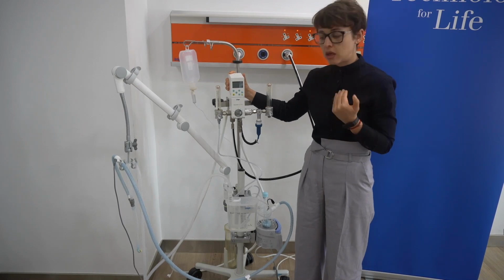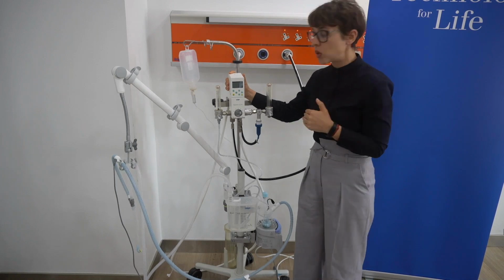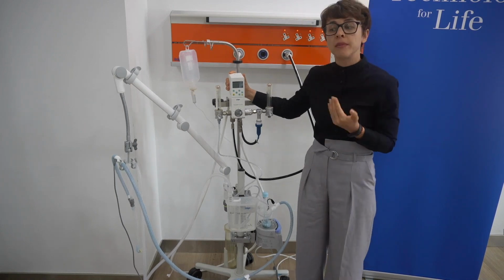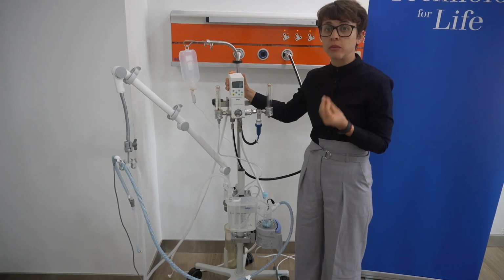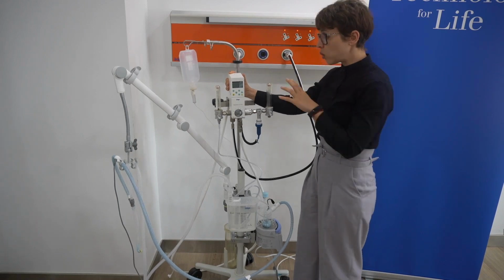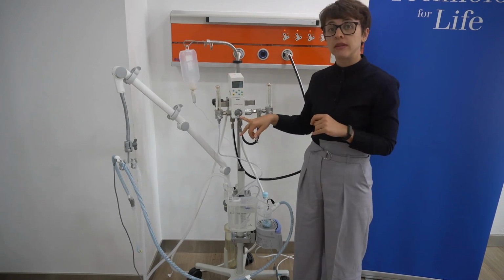Especially we know that there are certain conditions associated with the higher percent of oxygen, such as retinopathy of prematurity, and we have to be careful when selecting the oxygen mix.